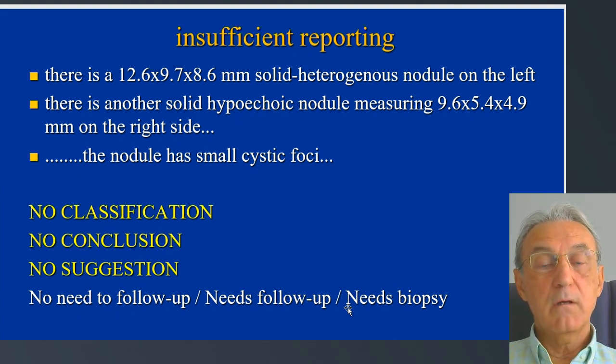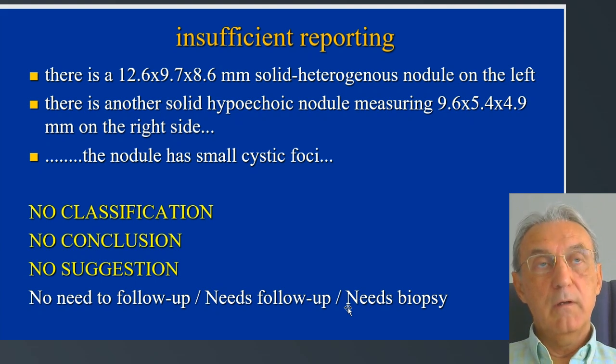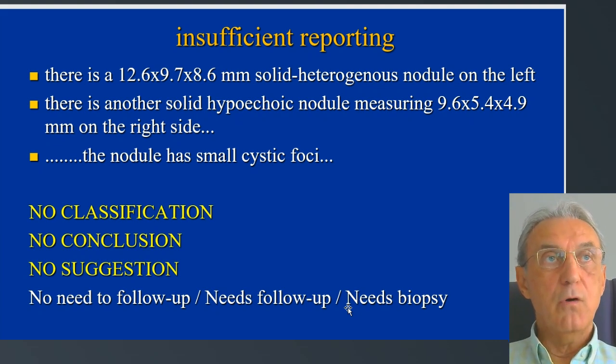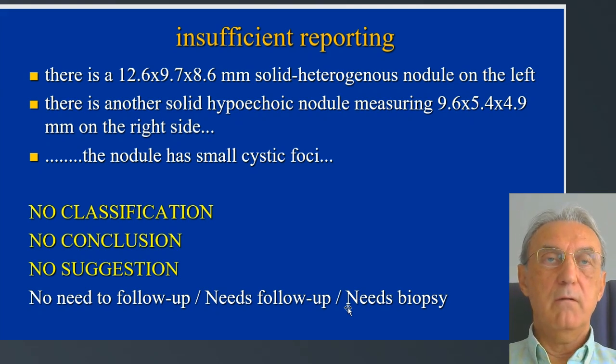And our reporting, whoever is doing the thyroid ultrasound, the radiologist, the radiology sonographer, or the endocrinologist, or the internist, or the surgeon, the report should be sufficient, should describe everything, and not only description of the nodules, but a classification, stratification using one of the guidelines or the TI-RADS classification systems, and there should be a conclusion at the end of the report, and there should be a suggestion at the end of the report.